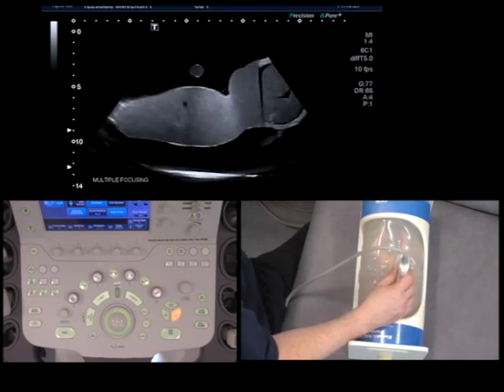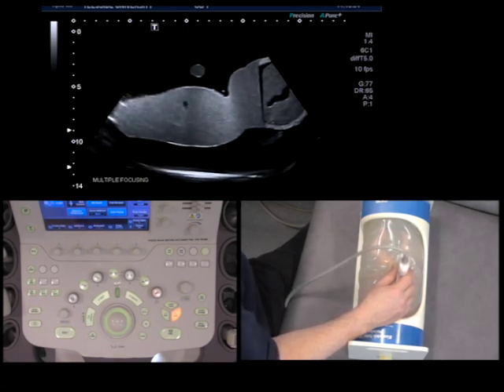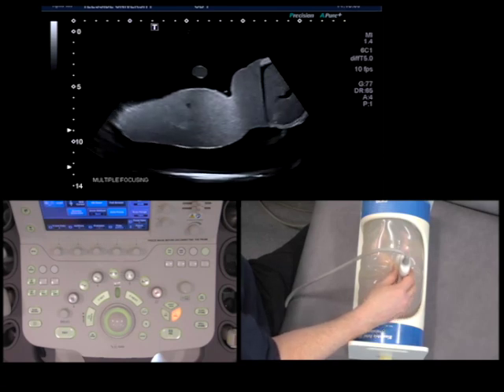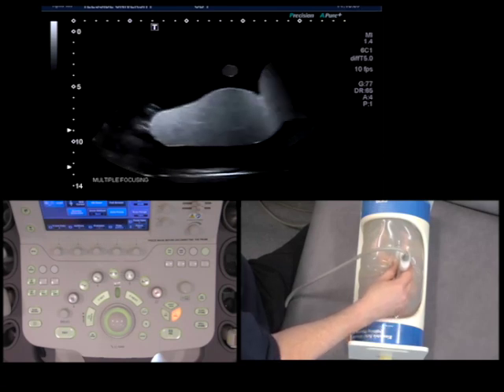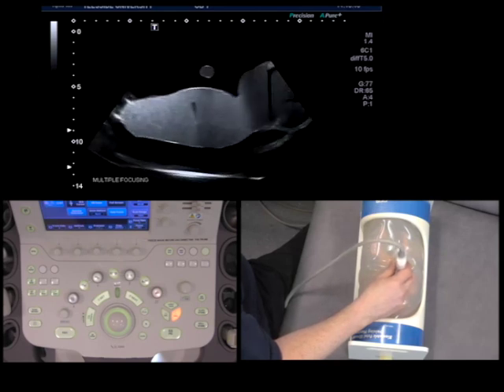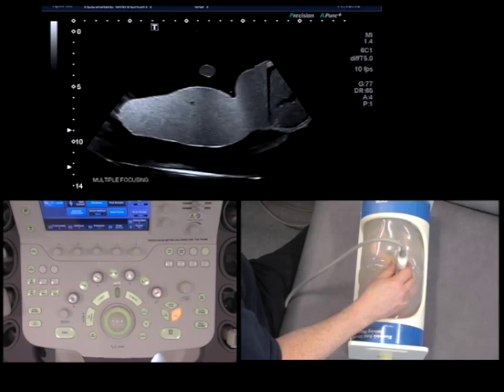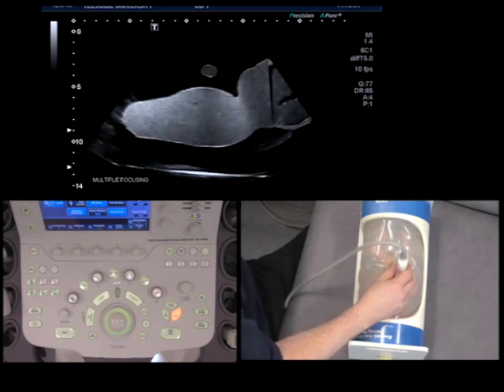That is something called temporal resolution. Temporal resolution is the ability to see and to actually resolve a moving object. If we're just moving the probe around, 20 frames per second is perfectly fine. But if we have a faster moving structure, such as the fetal heart, then we need to have a higher frame rate.